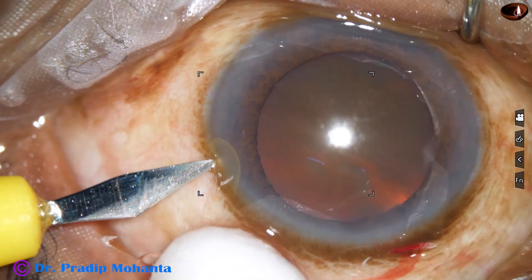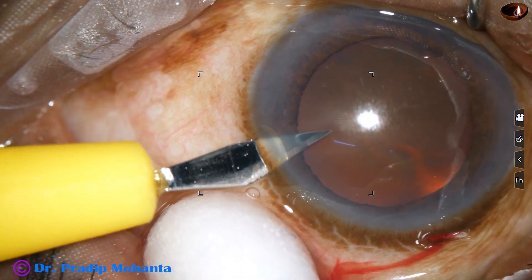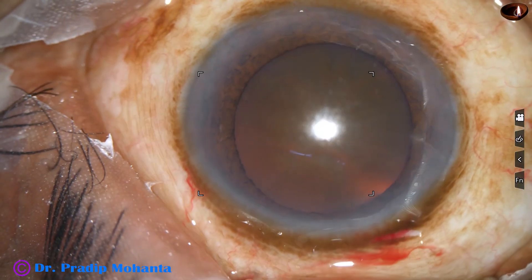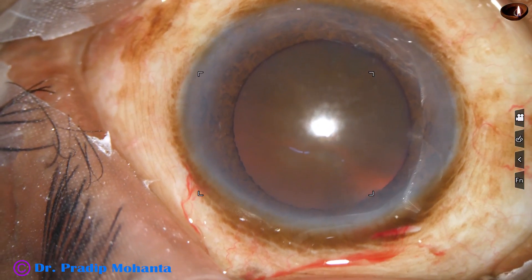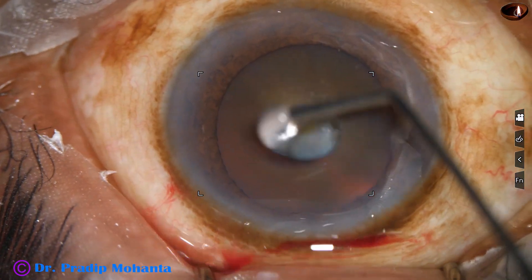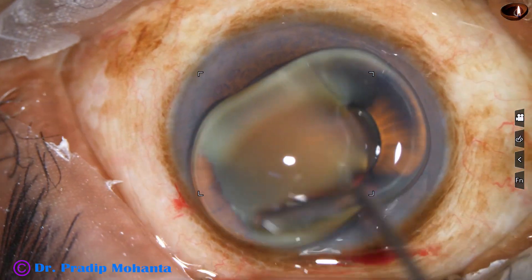The side port is about 3 o'clock away from the main incision. The whole width of the side port is at the mid-limbus or posterior aspect of the limbus.